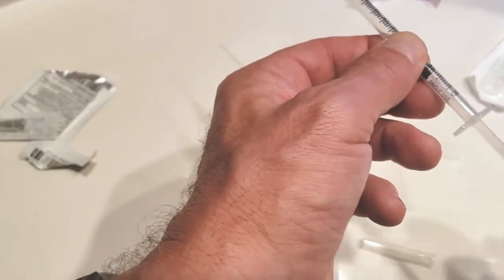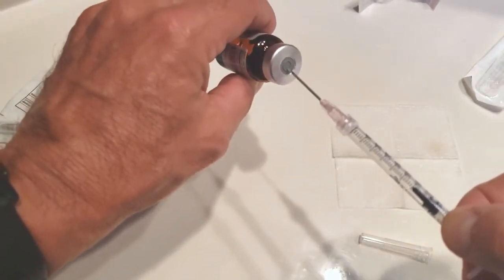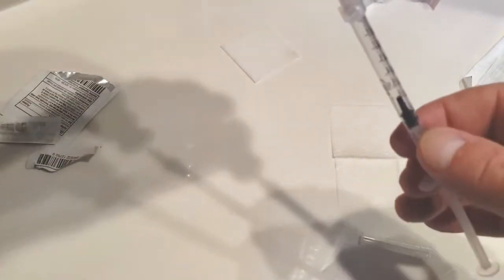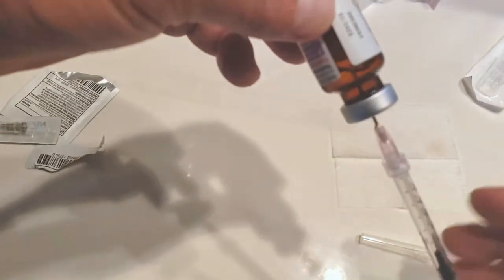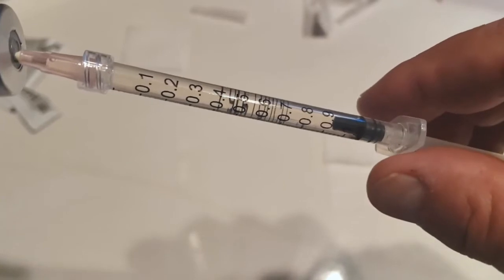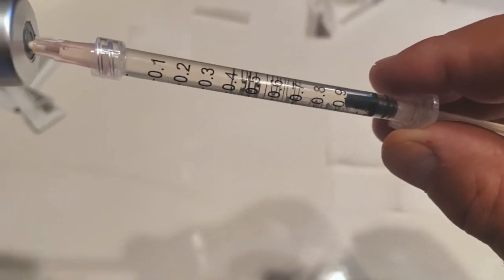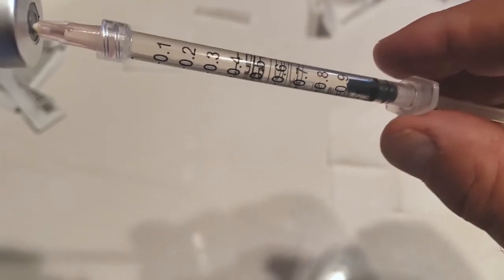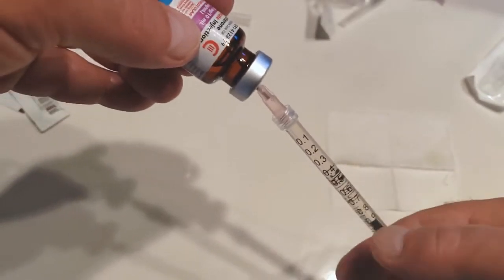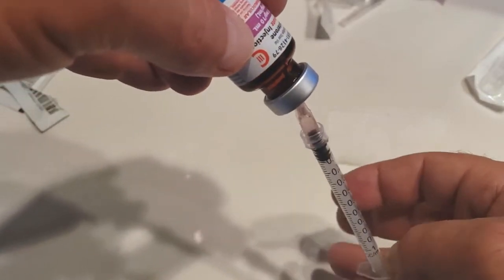I put some air into the syringe and gently puncture the diaphragm with the 18-gauge needle. Turn it upside down so that you can see the fluid level. Here you can see the markings on the syringe in increments of 0.1 — 0.7, 0.8, 0.9. First, inject air up into the bottle to create a little pressure.